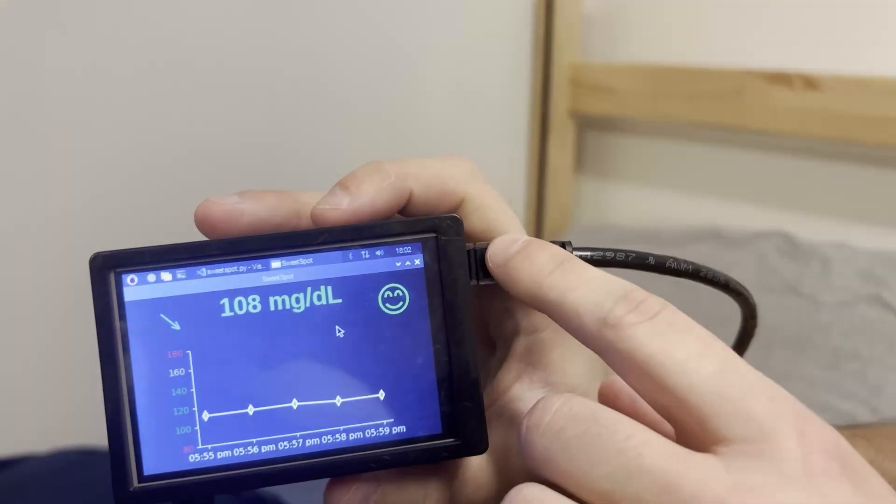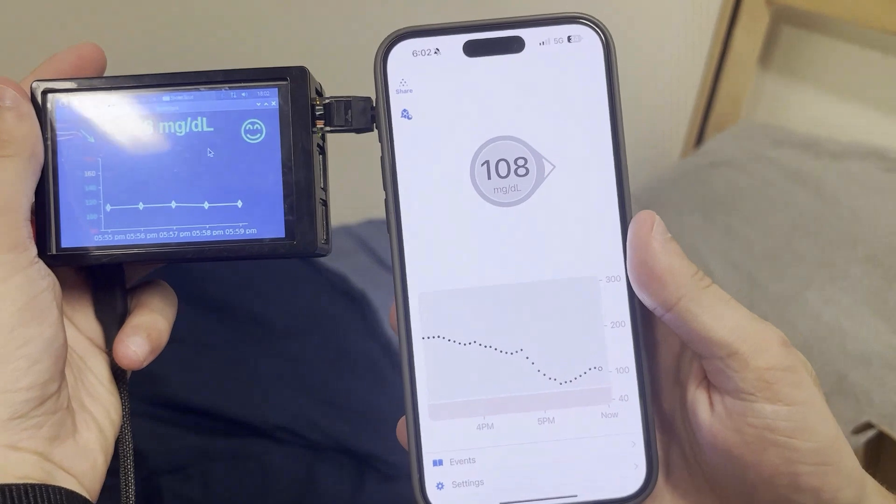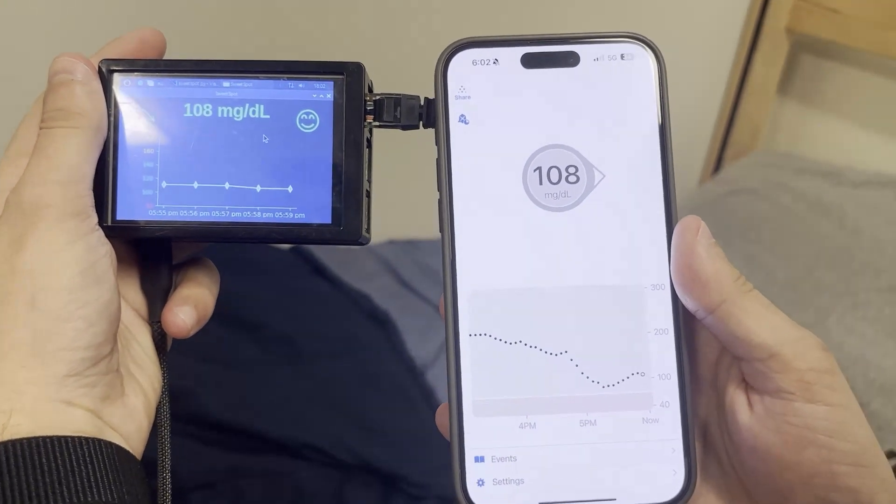And then we have the ethernet going in and the power cable. And if we look at my phone we can see that it's displaying the exact blood sugar that we have in the cloud.